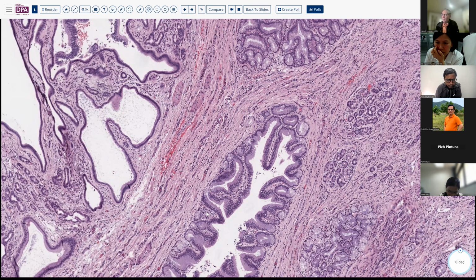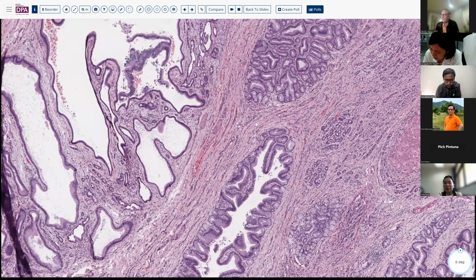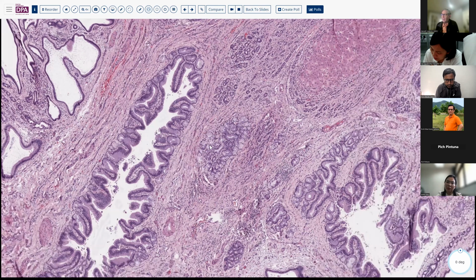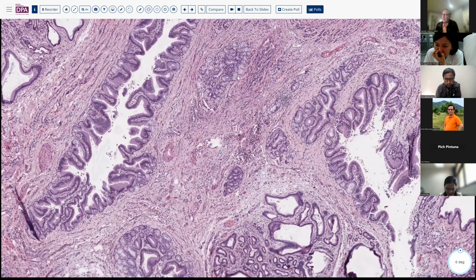And then here would be a more fully developed early dysplasia type of thing with enlarged cells, a little bit of nuclear enlargement, and some crowding. And as you can see in the liver, this is admixed with other degrees of metaplasia and biliary ductal proliferation as well that gives it this appearance.